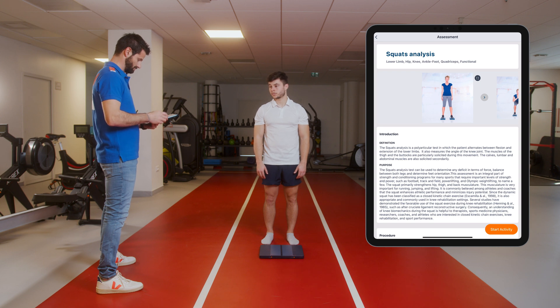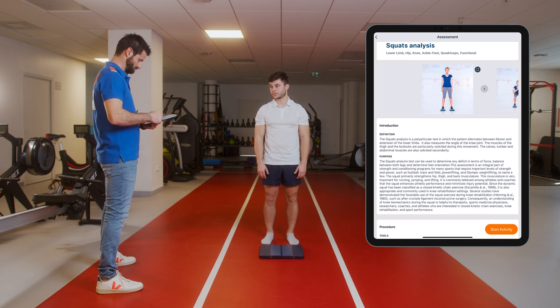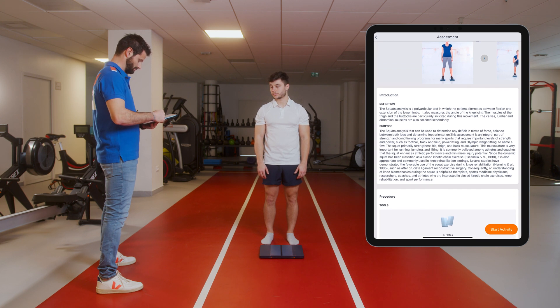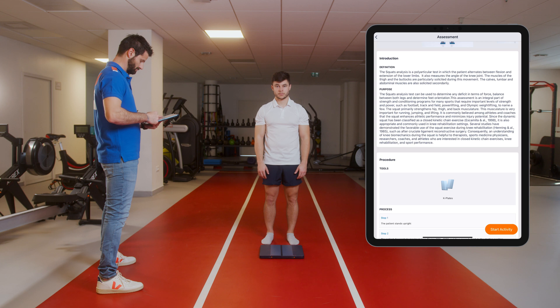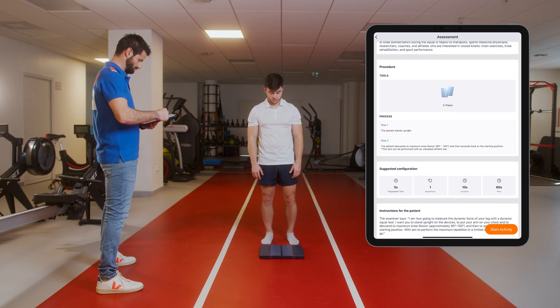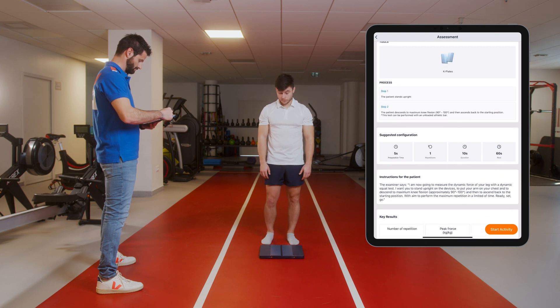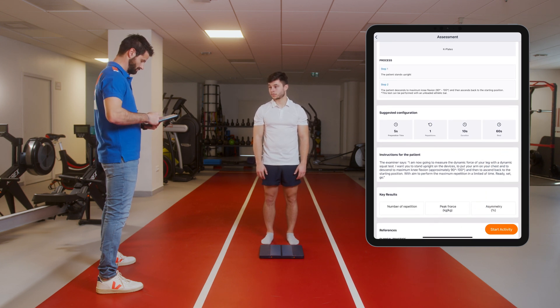In order to do this, we will use the Kinvent K-Force plates. You have to select the exercise in the filter, so for this one, make sure to choose the squat analysis.